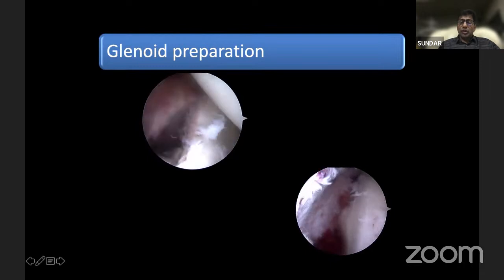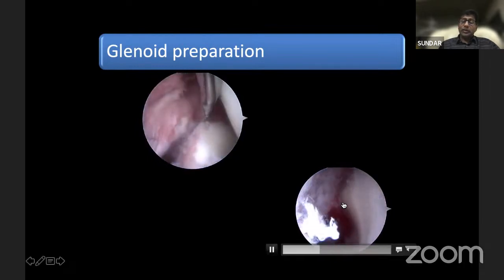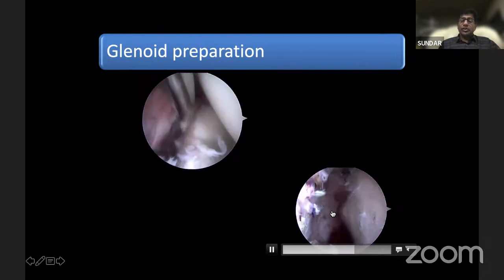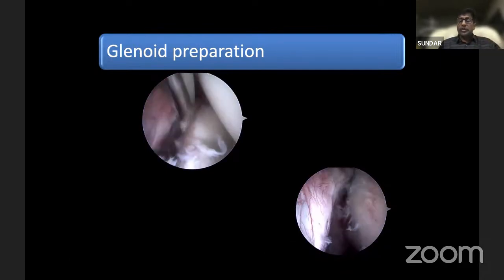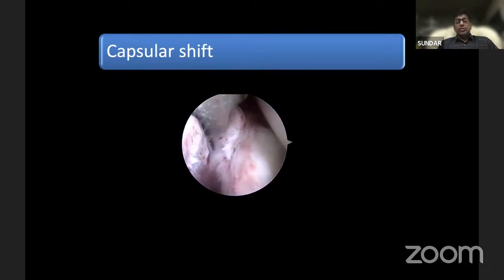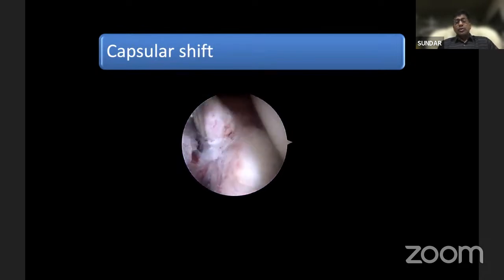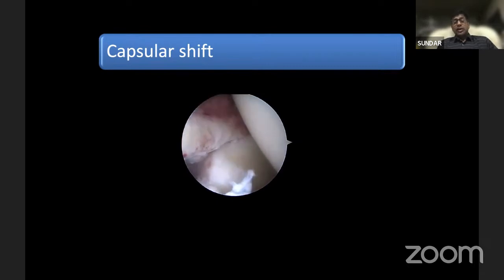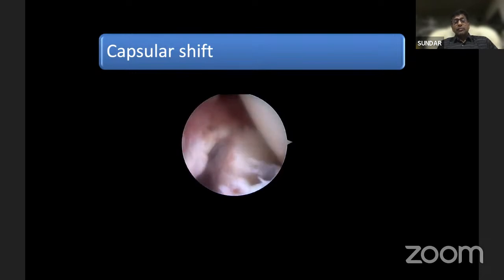So you can see this is how you separate. You can see the entire medial part of the glenoid. What you see down is the subscapularis muscle. Without liberating from inferior to superior, it is impossible to liberate your entire labrum to bring it to the glenoid level. So that is a very, very important step, so take your own time. This is how you bring your labrum. Once you do the liberation, you bring it up, then you shift from inferior to superior. That's how the labrum comes to its original position.